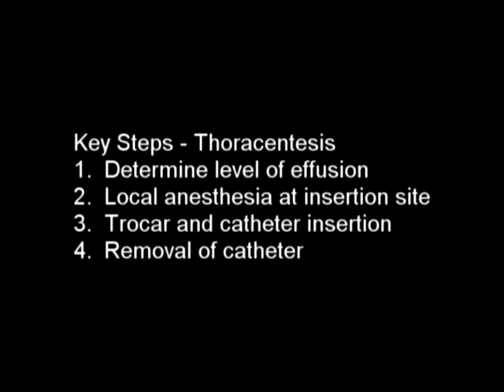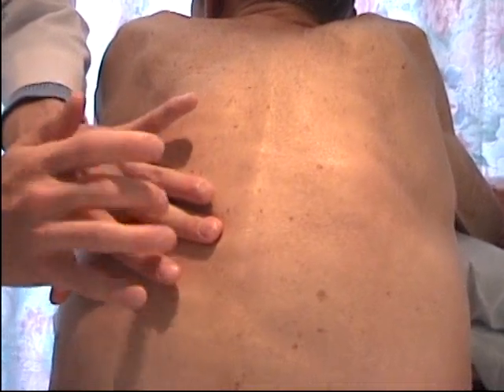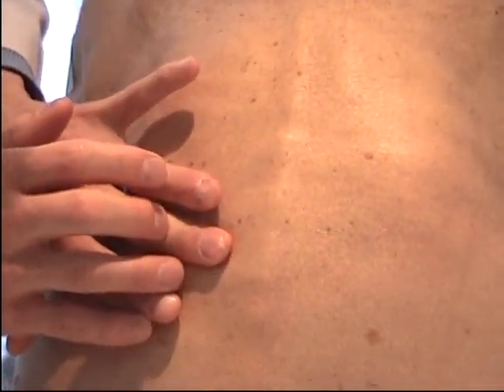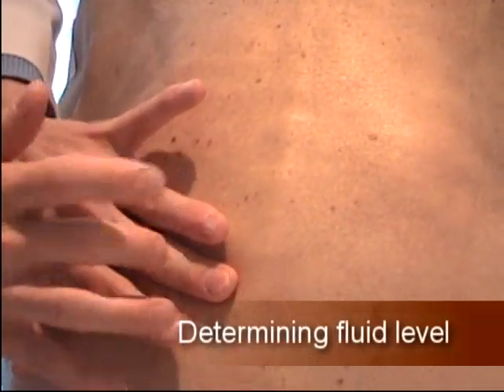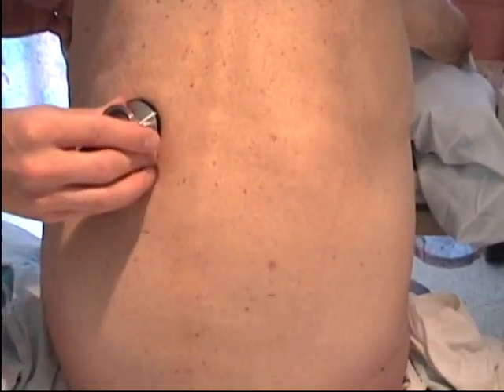Key steps: thoracentesis, determination of level of effusion, local anesthesia at insertion site, trocar and catheter insertion, removal of catheter. Prior to performing a thoracentesis, the operator must determine the level of pleural fluid with the patient sitting in the upright position. This can be done with percussion of the chest or egophony.